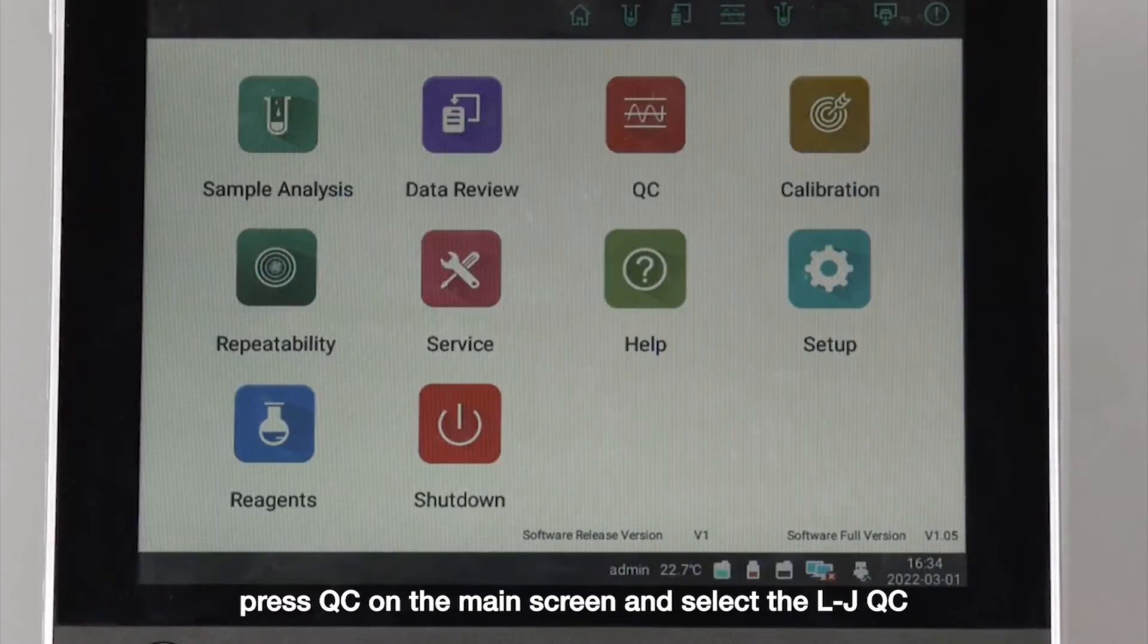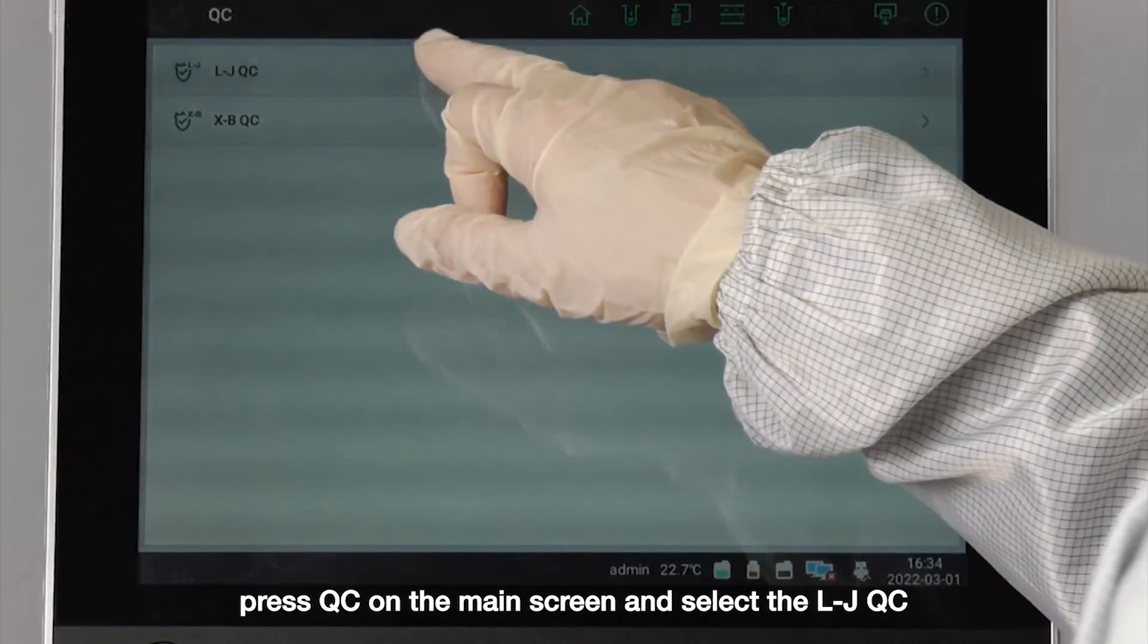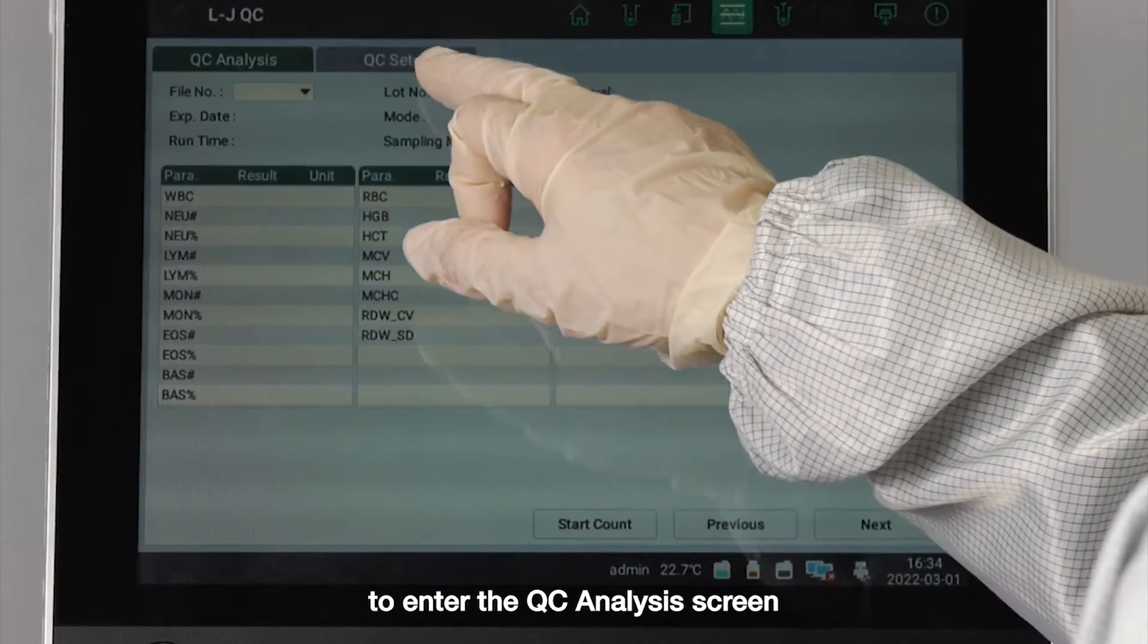Press quality control on the main screen and select the LJ quality control to enter the quality control analysis screen.